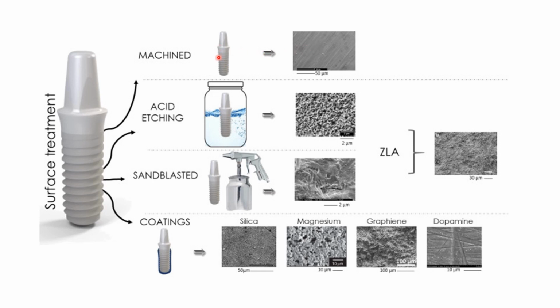Then came the machined implant, that is, the implant surface was machined to give a matte finish. Even these implants were made using pure titanium or titanium alloys, but they were not very encouraging because the bone integration was delayed and there was mainly fibro-osseous integration. Then came the acid etch implants, also known as SLA implants. Okay, so SLA implants encompass both of these things.